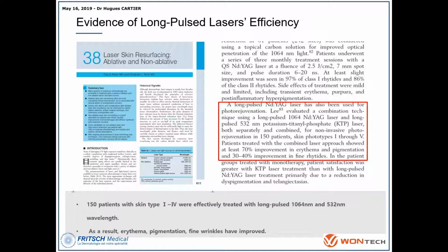And with a good setting, you can also combine for skin rejuvenation, skin remodeling, if you combine both, or also for superficial and deep vascular disease. So it's easy. If you understand that, you can modify the setting and you can treat many indications in dermatology also.